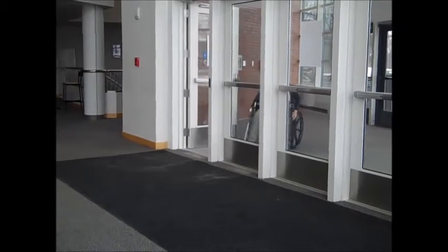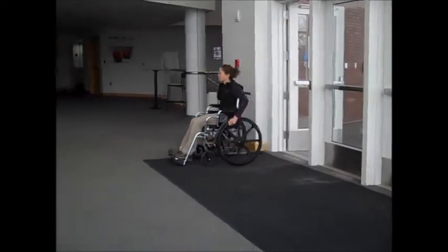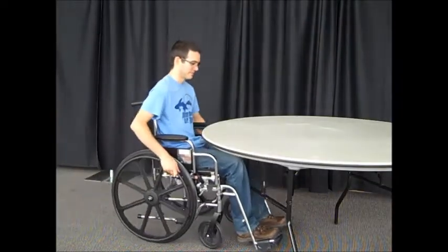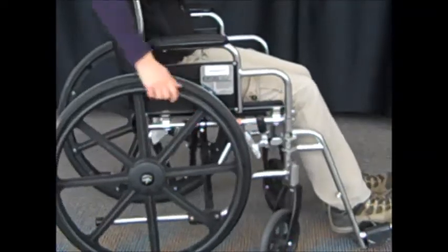Wheelchairs provide a form of transportation for people with cognitive or motor disabilities and impairments, providing integration into everyday life. During this video, we will explore the basics of wheelchairs, including proper fitting as well as positioning and forces in propulsion.